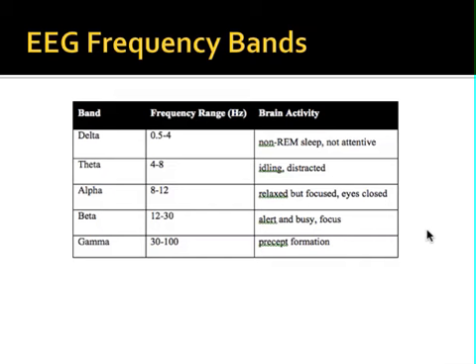How it's divided, and even the entire beta frequency range, is not consistent throughout the literature, and you will see some places where beta is defined from 12 to 24, from 12 to 22, and in this case in our table we have it from 12 to 30. So just keep in mind that that upper number is somewhat dependent on what resource you're looking at.